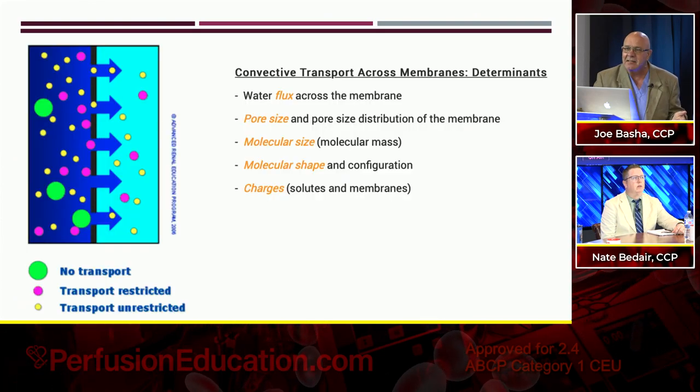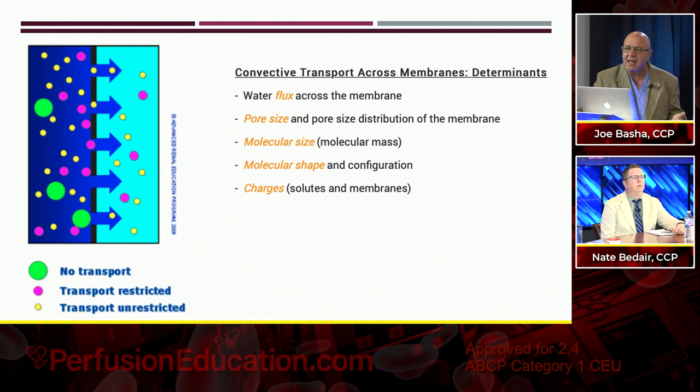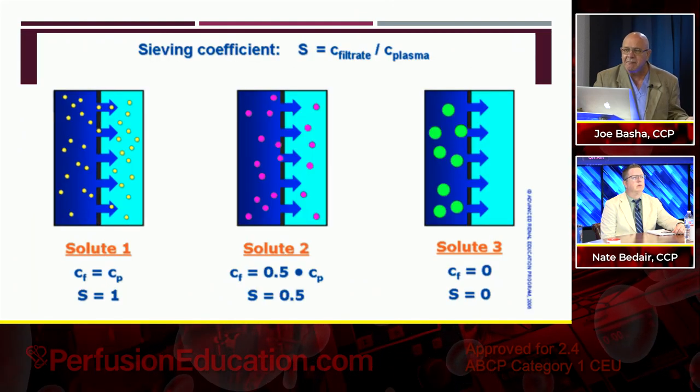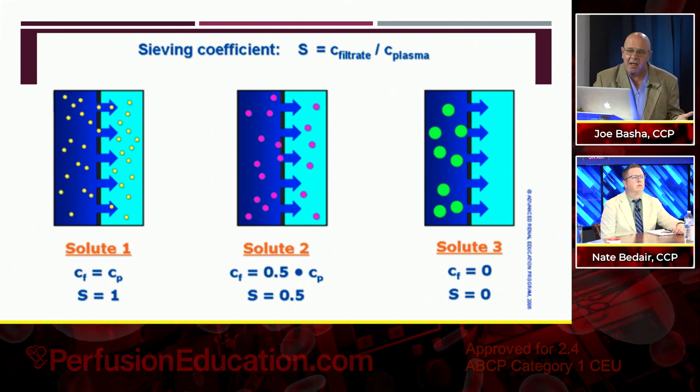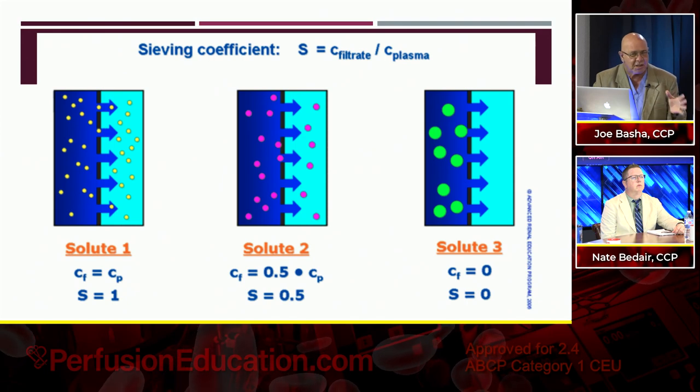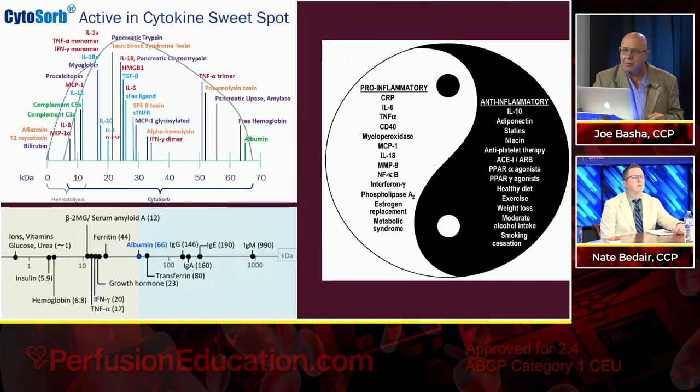And here's another example of that: a sieving coefficient of 1 versus a sieving coefficient of 0 and what that would look like moving from left to right. So we talked about sieving coefficient. This is just a refresher. I'm going through it very quickly.